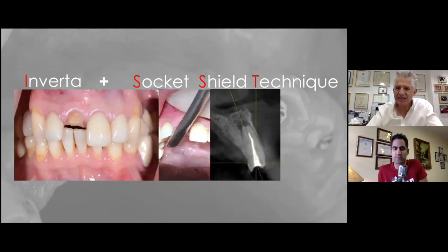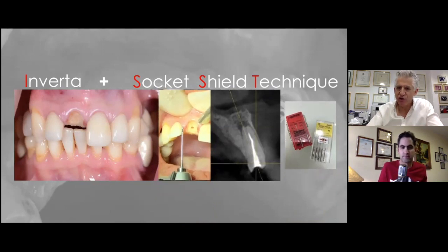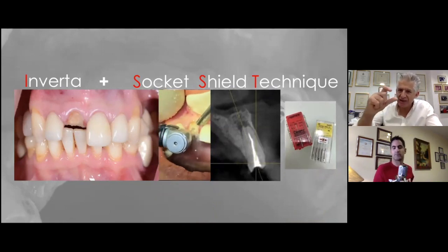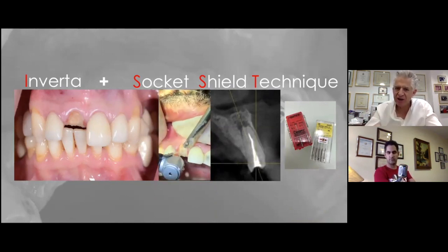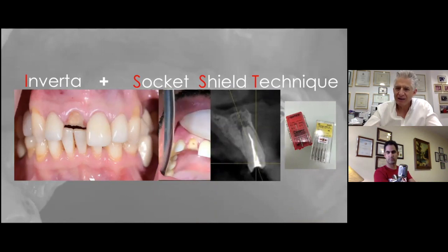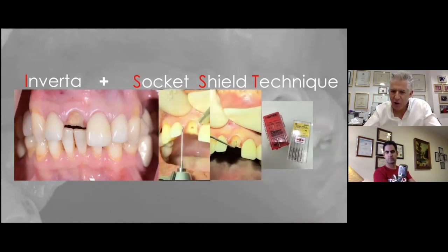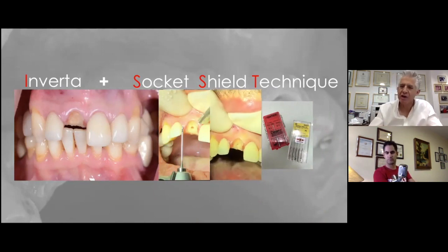So we gain access into our root canal filling material, and we then use our Gates Glidden drills to the predetermined length that we've determined from our CBCT or from some x-ray that we've taken. And we take a perioprobe, we verify that we've gone to the depth that we know we should go to get to the apex.